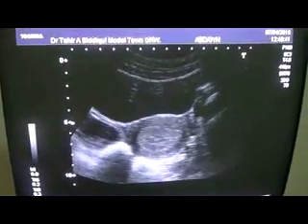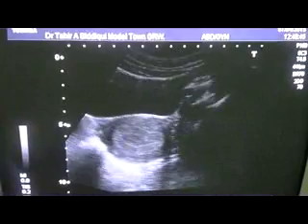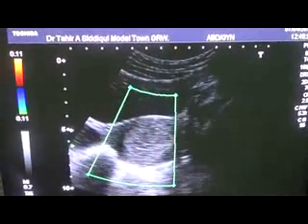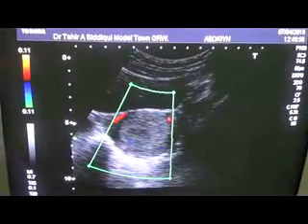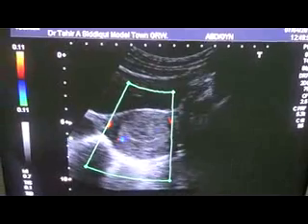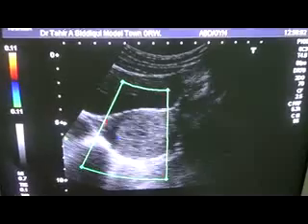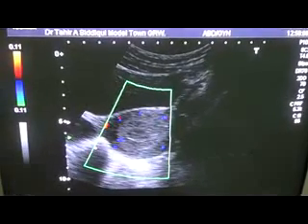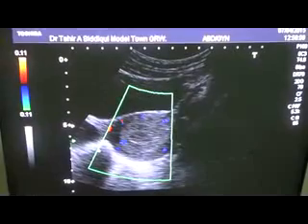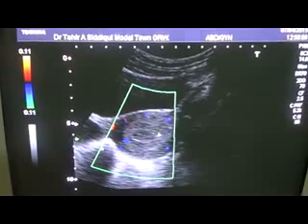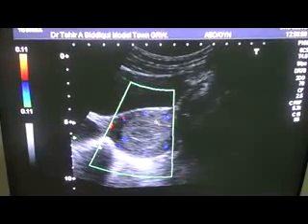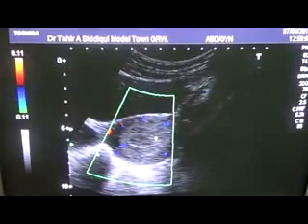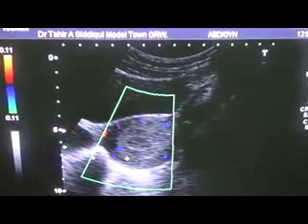Going to the transverse view and applying the color box, minor vessels are seen within it. Small, tiny vascular structures are seen in the myometrium outside this echogenic area, which has a central hypoechoic area with fluid within it, as we saw in longitudinal section.